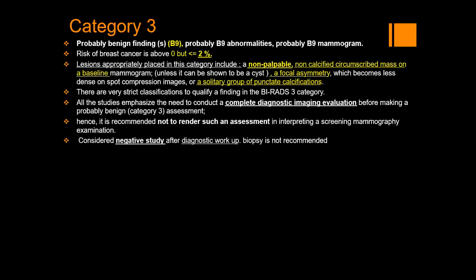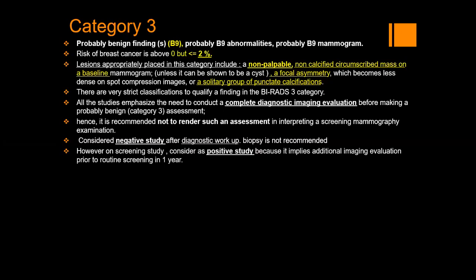It's considered negative after diagnostic workup because there is no cancer. But if it's used in screening mammography, they consider it as positive. Why?